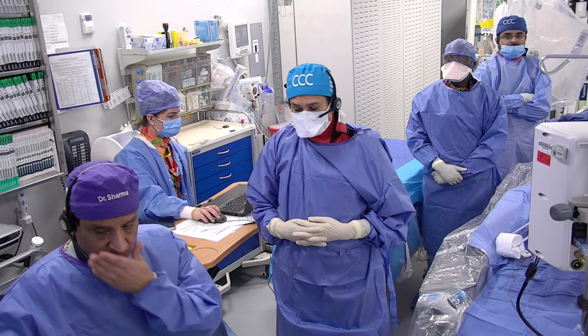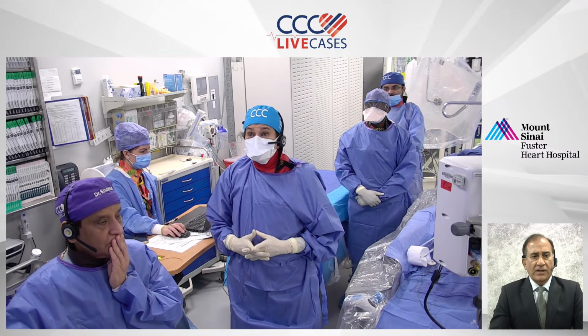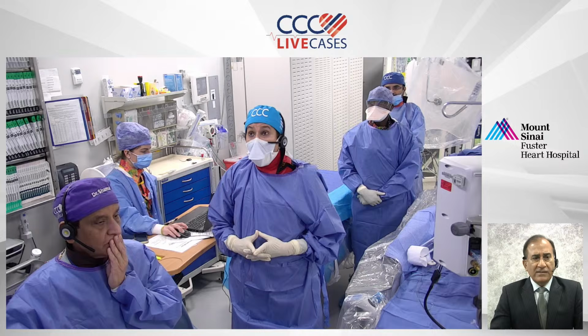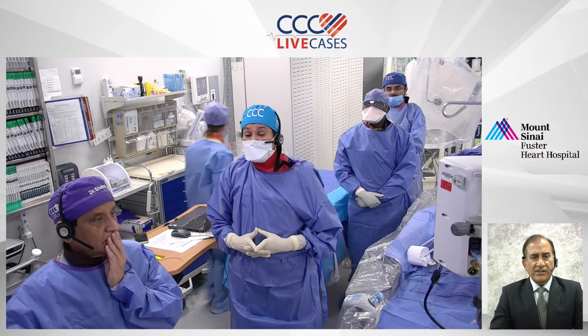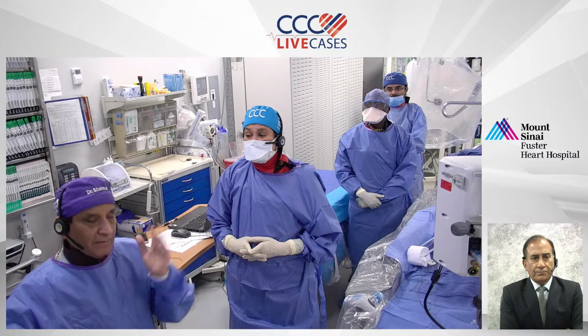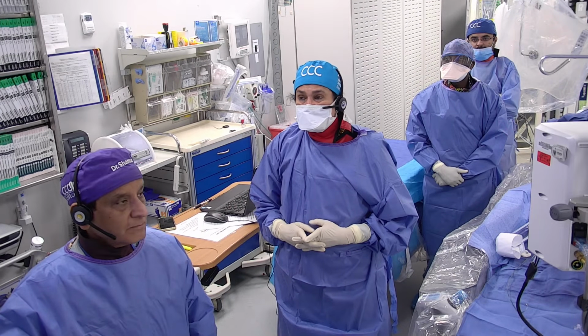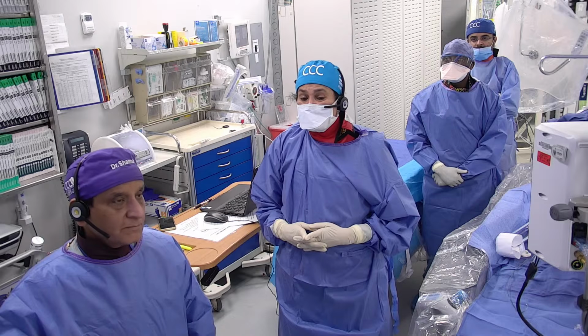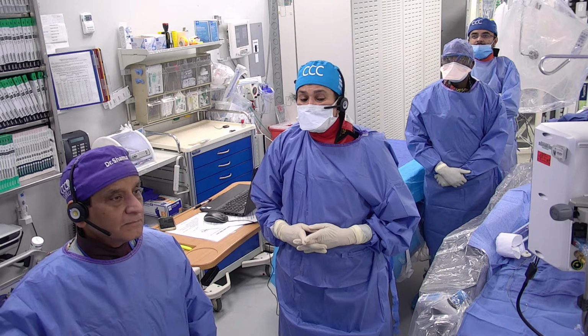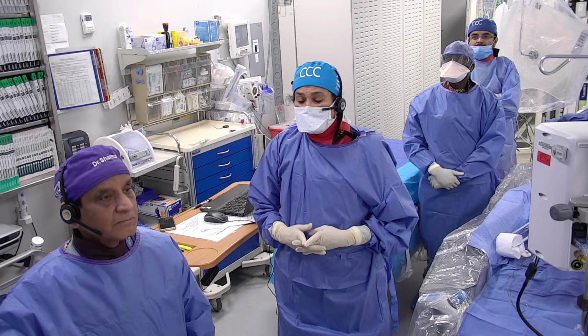Excellent. Now, Dr. Jha posed a question which leads to a bigger issue: in hindsight, should this patient have had a balloon-expandable TAVR? 100%. No question. Which then raises the question of whether there should be some unwritten, informal recommendation that if a patient has a 50% lesion, they are better off with the balloon-expandable?